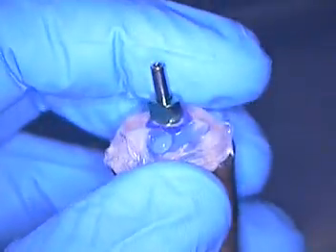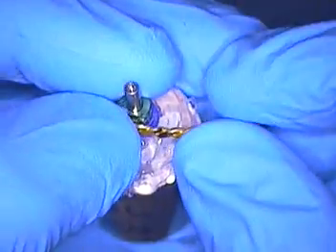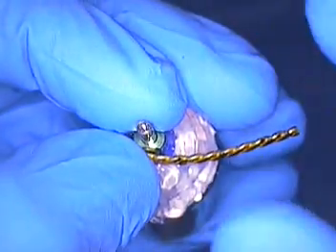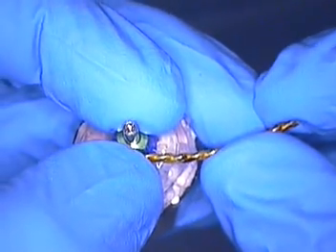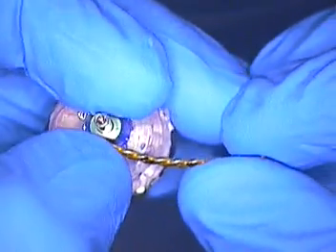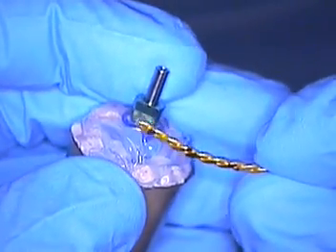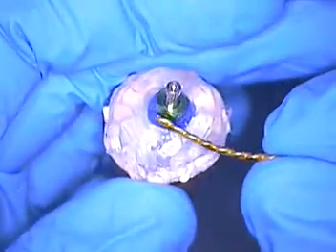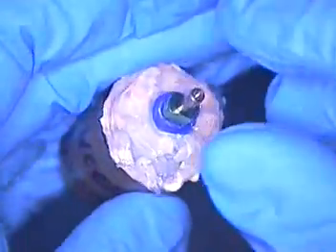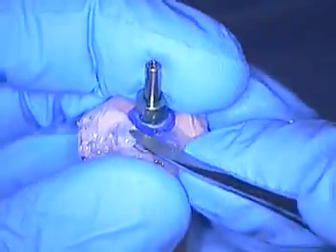This technique also includes these bars. These will be light-cured in place so that when we take the open tray impression, this braided wire will hold them all together — frozen. Then we'll get our impression, and I'll show you how I adapt the analogs to fit these impression copings. Then we put another bar on them and pour our model. So we've got bracing not only in the mouth, but also the analogs together.